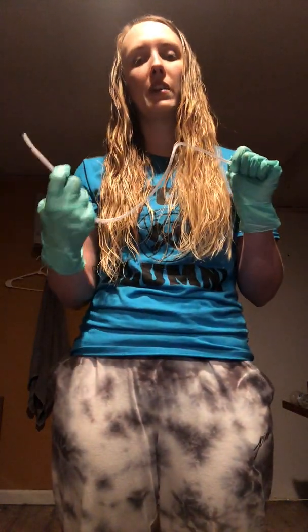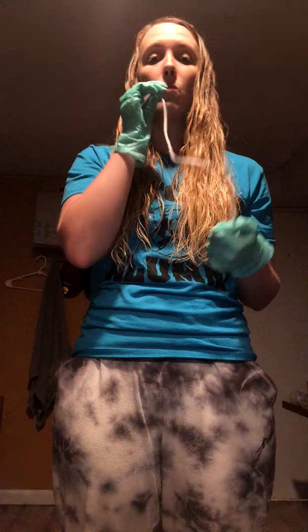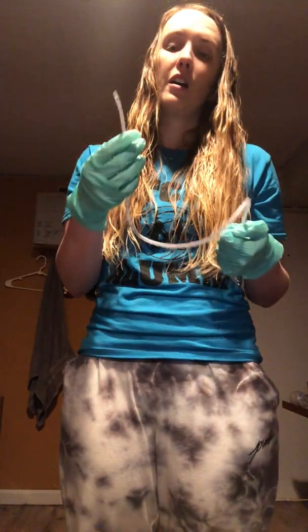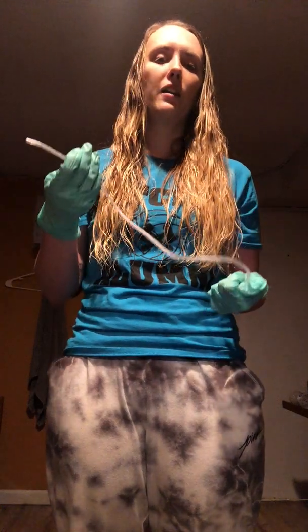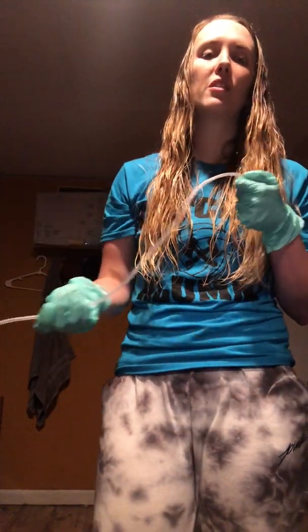When you are suctioning, you want to limit that suctioning to about 10 to 15 seconds. You don't want to do it any more than that during a single suctioning. And after you do it once, and say you need to do it again, you want to give the patient at least about a 20-second break. That way they can gather themselves and catch their breath. So say I need to do this again.